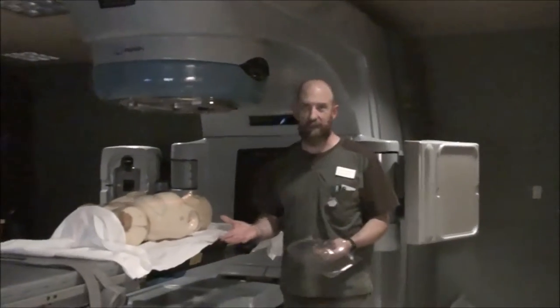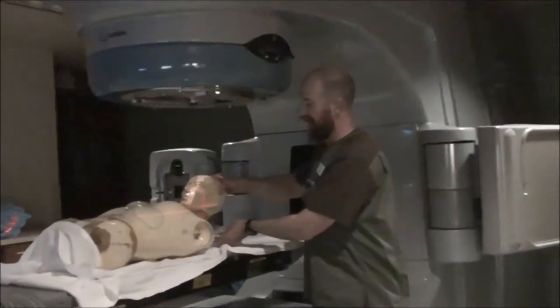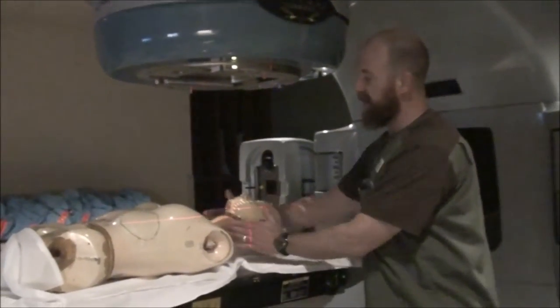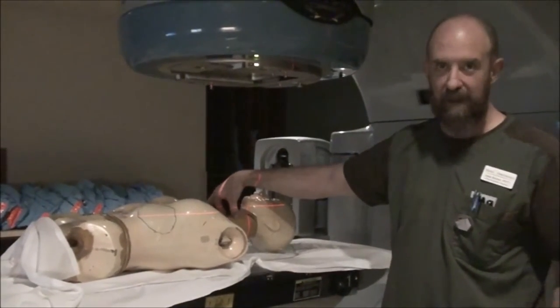On Pixie, you probably need a D headrest, but I'm not going to get that out. I'm just going to demonstrate the fact that you want to have a headrest that will hyperextend the chin a little bit so that you have good clearance — you're not going to treat through the mouth, and you can get to the laryngeal area easily.